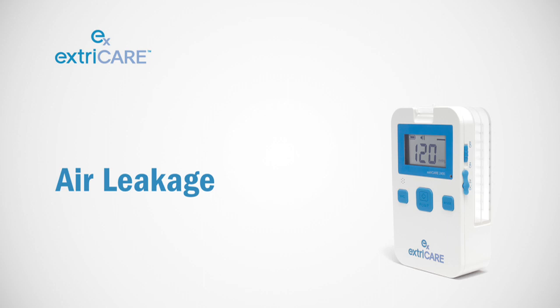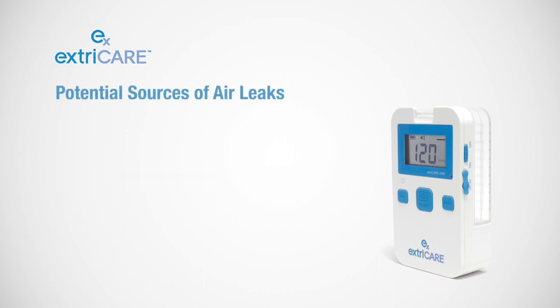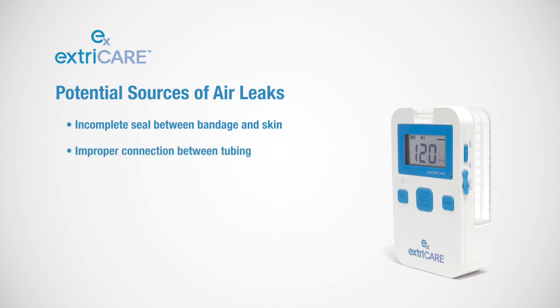There are various potential sources of air leaks, including an incomplete seal between bandage and skin, improper connection between tubing and/or canister leakage.